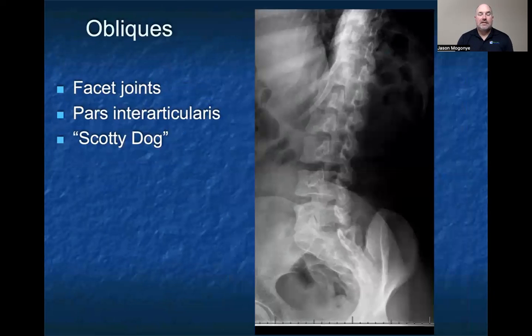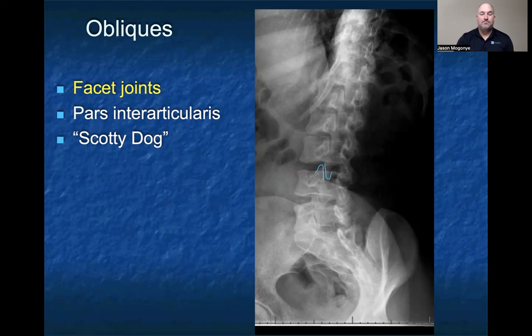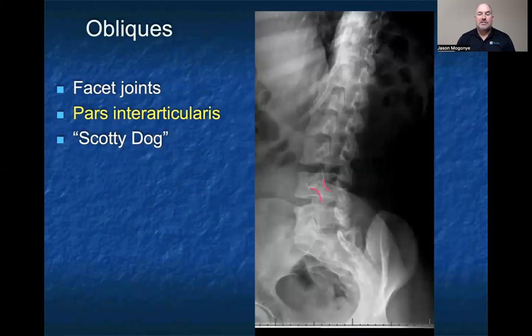In looking at the obliques, this is where you're looking for your facet joints, your pars interarticularis, and you want to be able to identify that infamous Scotty dog. When you talk about the facet joints, you have the superior articulating process coming from the level below and the inferior articulating process coming from the level above. This creates the facet joints, which help to limit extension and rotation of the lumbar spine. The pars interarticularis is famous for becoming fractured, and this is the view where you're going to look for that.